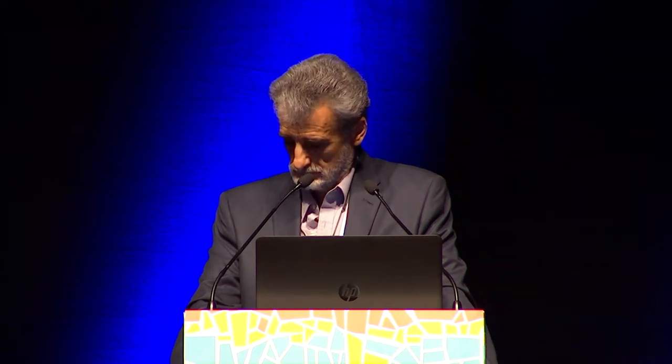I can answer maybe a part of it. I have done some vitrectomy for wet AMD cases when they have some vitreomacular adhesion, not traction, but adhesion, maybe almost 7-8 years ago. If they were unresponsive to anti-VEGF or had a suboptimal response, I couldn't get any change after vitrectomy, I can say. And we have done another study on AMD cases who have epiretinal membrane associated with choroidal neovascularization.